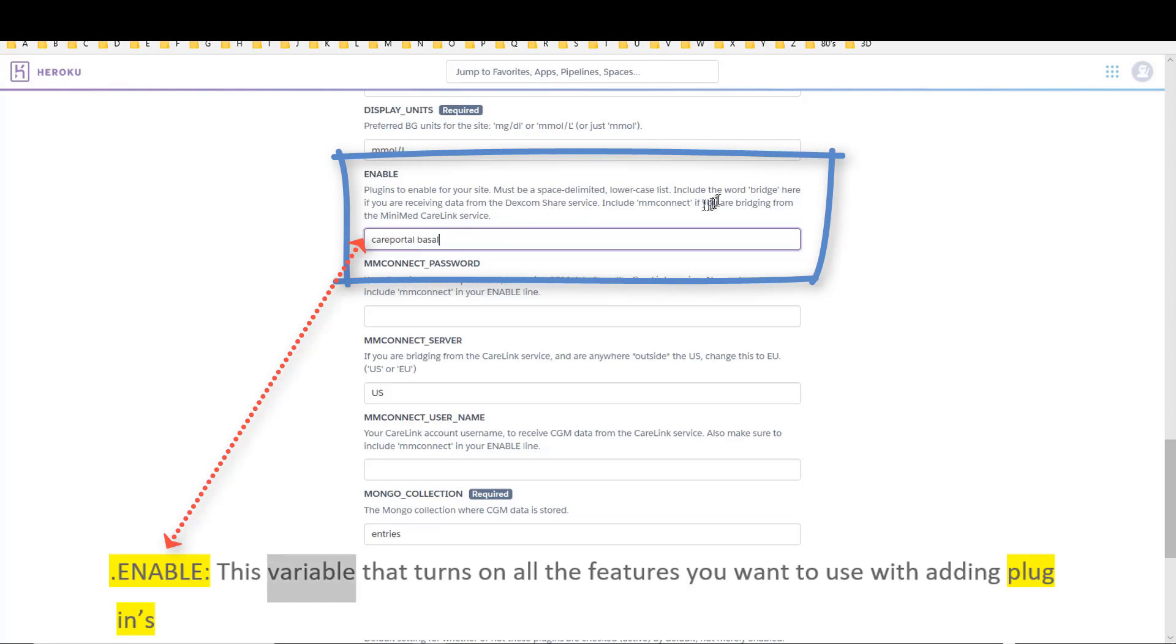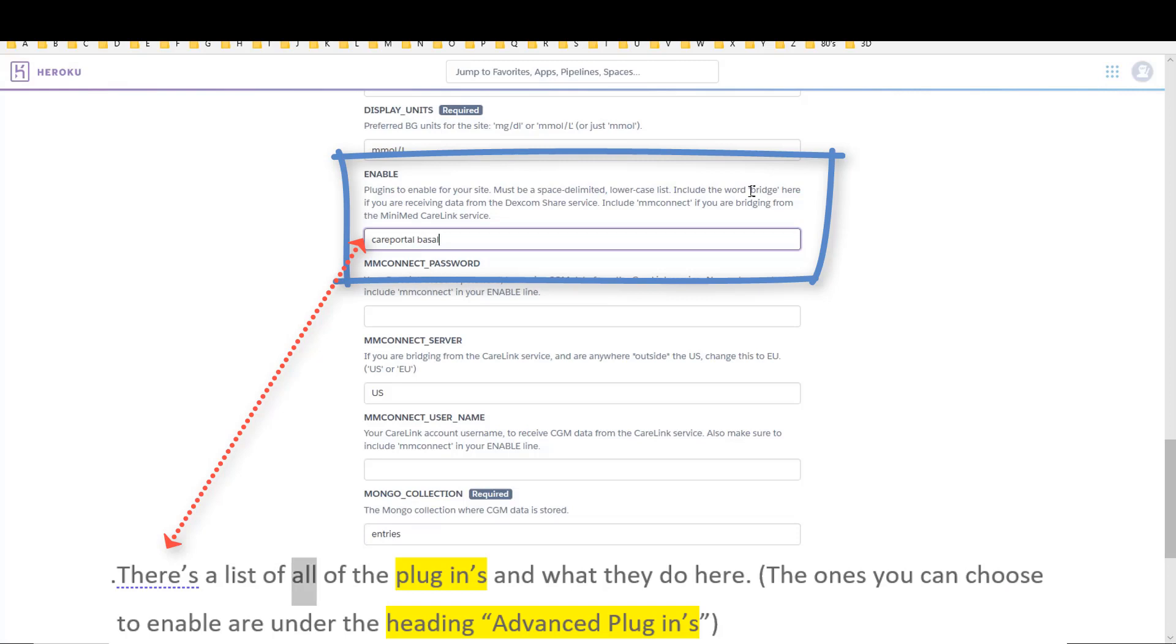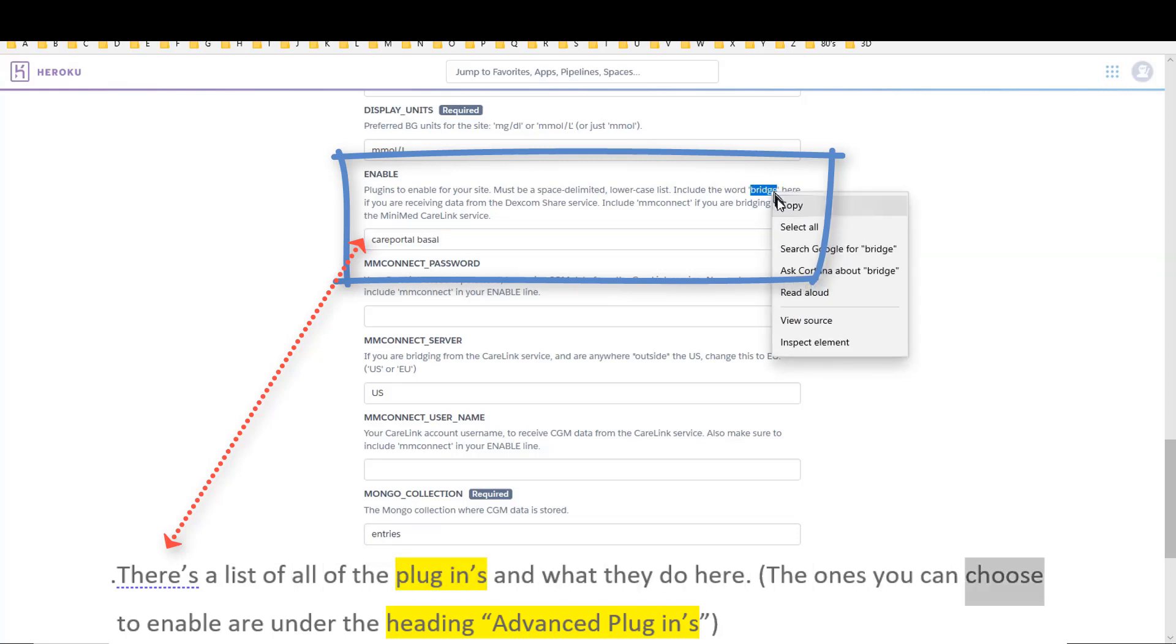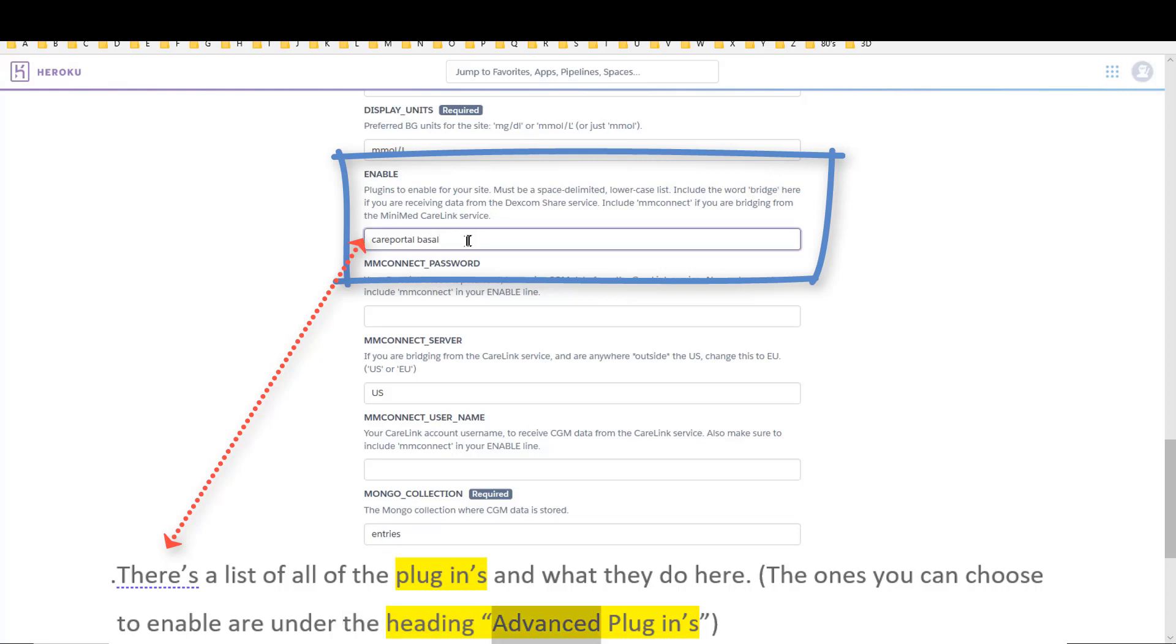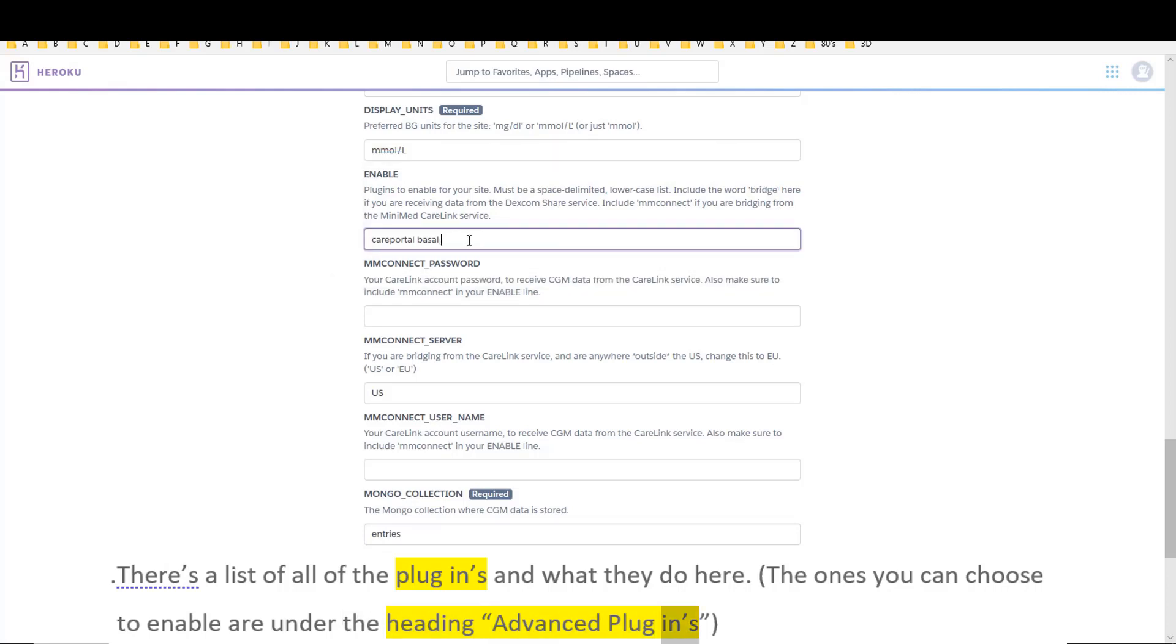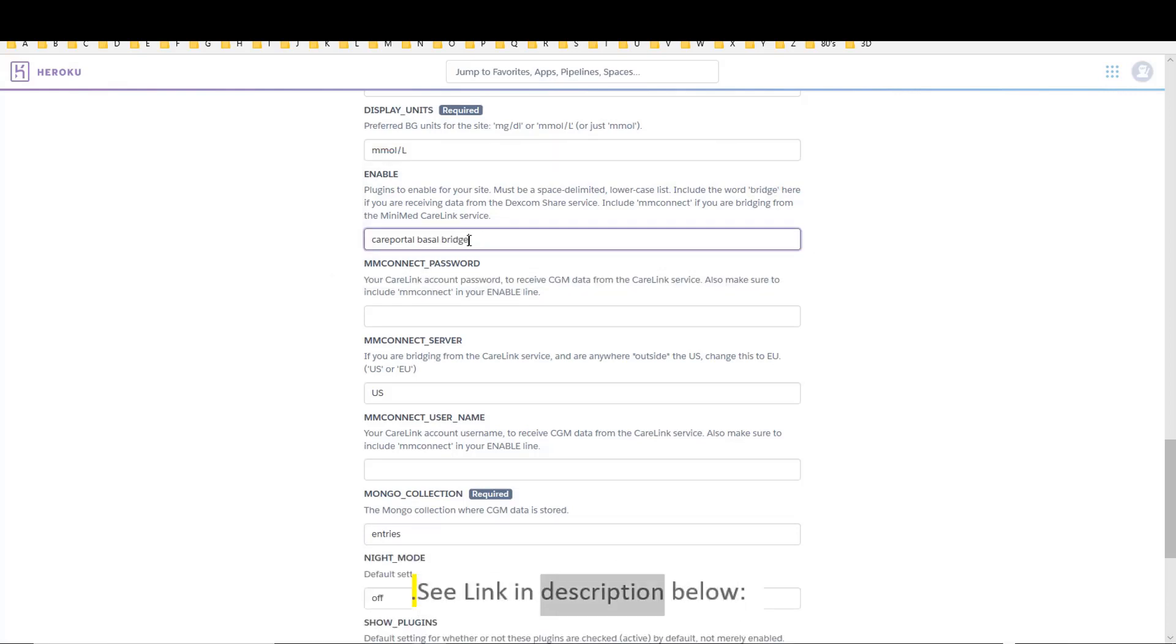Enable: this variable turns on all the features you want to use with adding plugins. There's a list of all the plugins and what they do here. The ones you can choose to enable are under the heading advanced plugins. See link in description below.